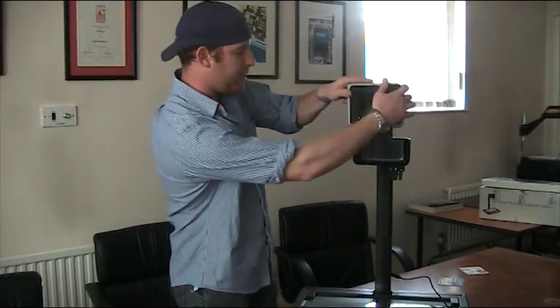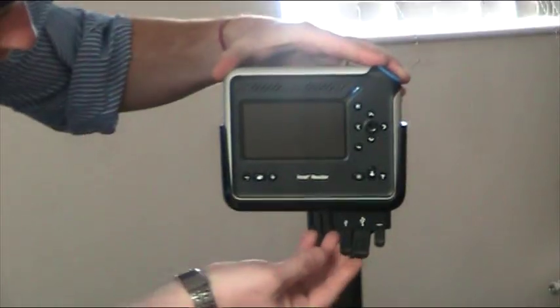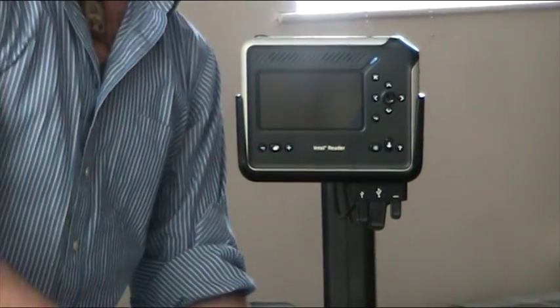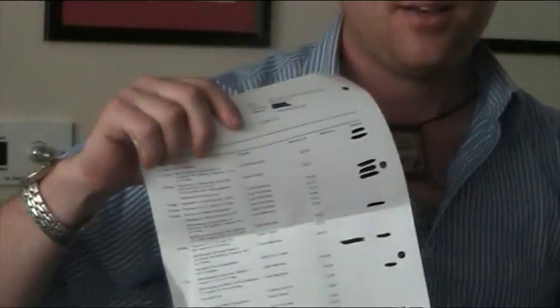We're going to put the Intel Reader right down inside. You have your various connection cables — your USB, your power — you just basically plug it in that way. On the back is where you have the output that can go right into your computer. Now basically what we're going to do is have three documents today that we're going to try out: my bank statement, a book by Robin Hobb, and a newspaper.